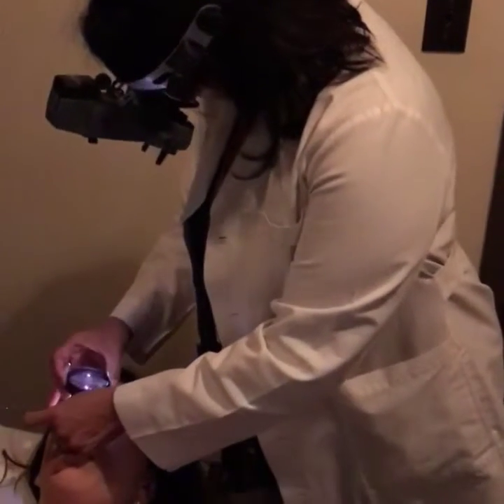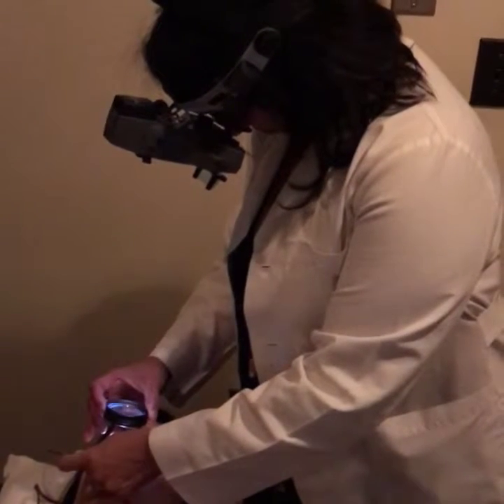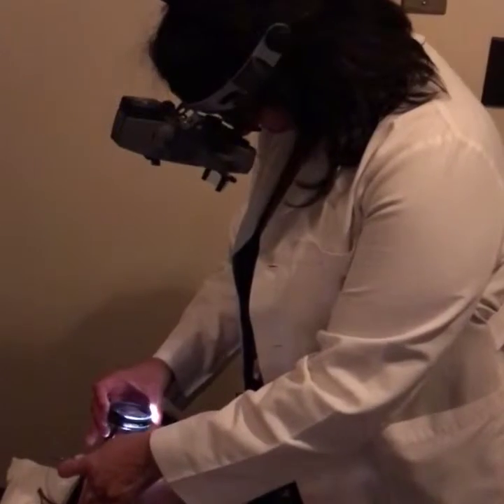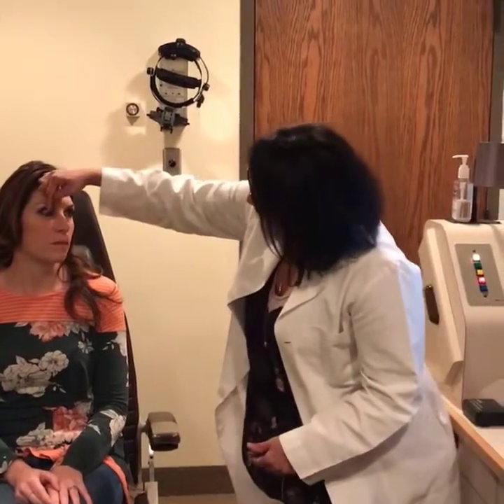Look straight down so we can see if there's any holes in the far peripheral retina — and this all looks very well treated. That scleral depression, or that indentation, pushes the peripheral retina into the view of the pupil. Using that 20 diopter lens, we can laser it through the pupil and still treat that far-out area, because that part of the retina is right up near the colored part of your eye — we have to push it in to see it through the pupil.